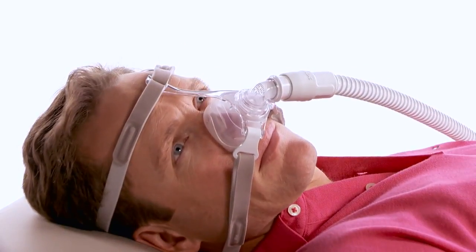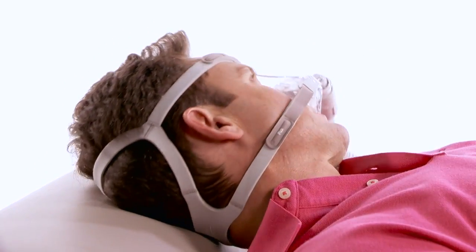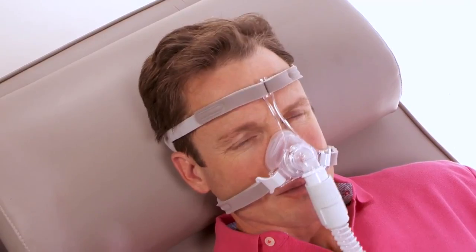To fix PicoMask leaks, lie down for final fitting adjustments. With your air pressure at the prescribed level, turn your head from side to side.